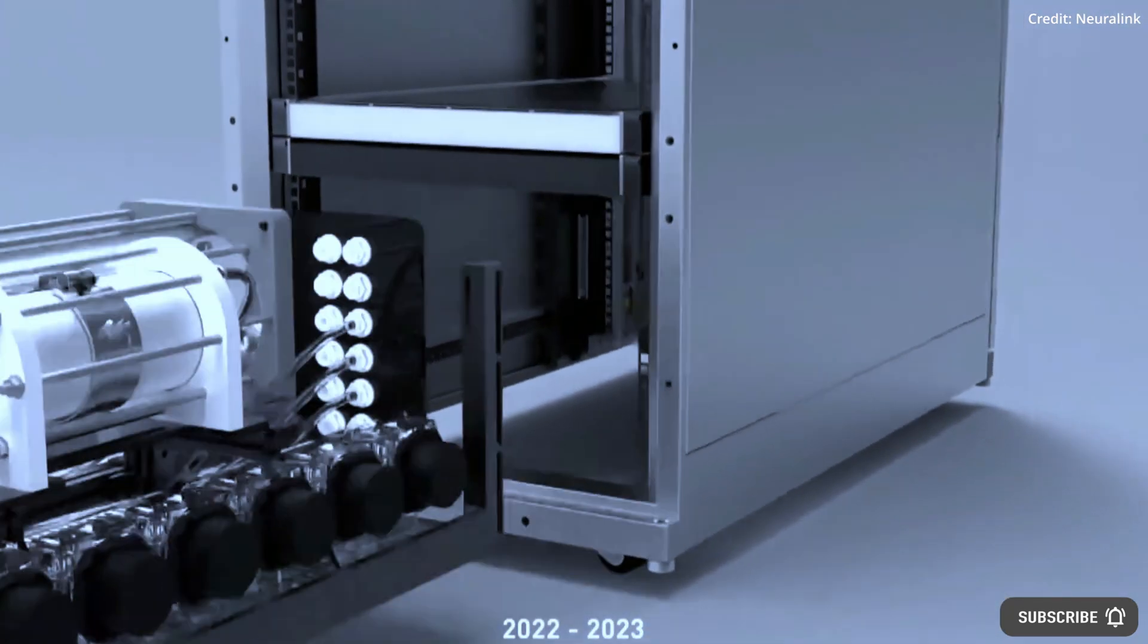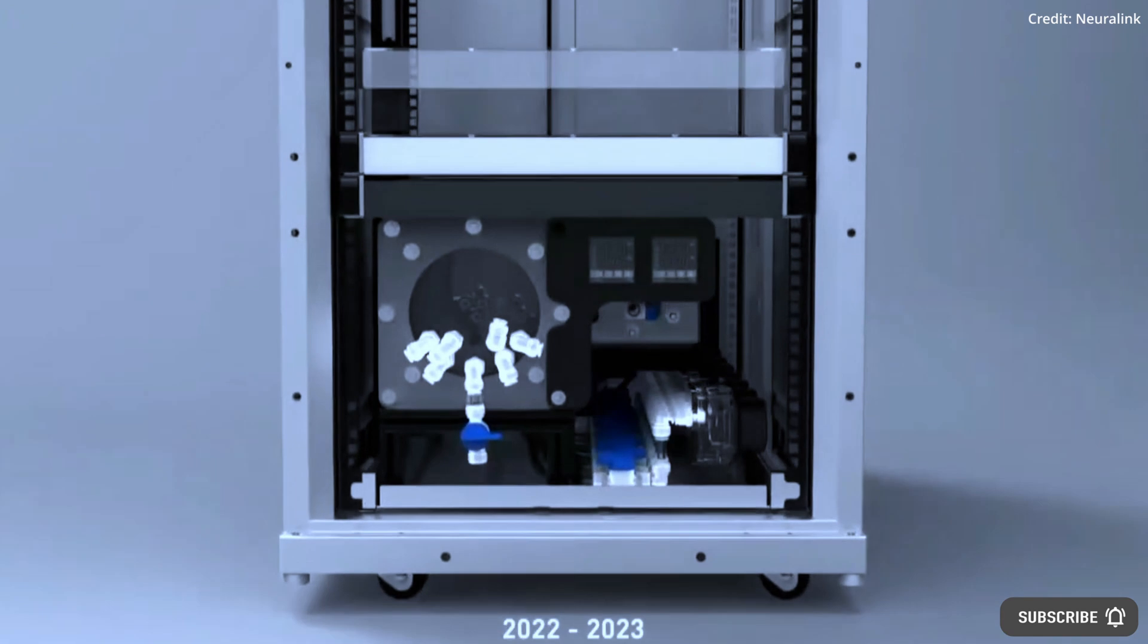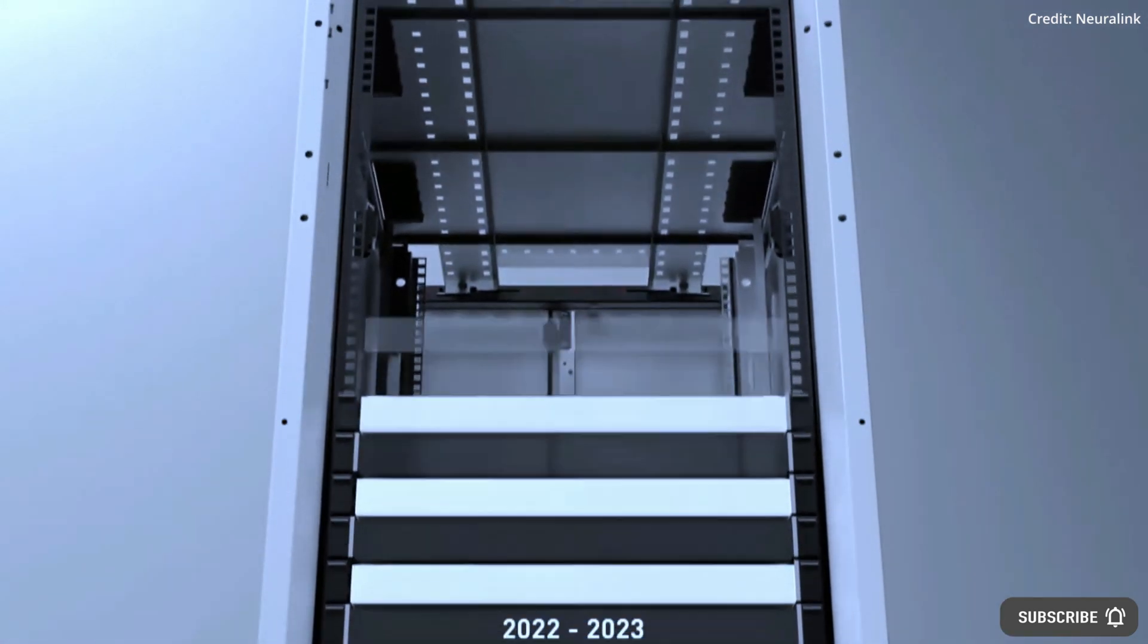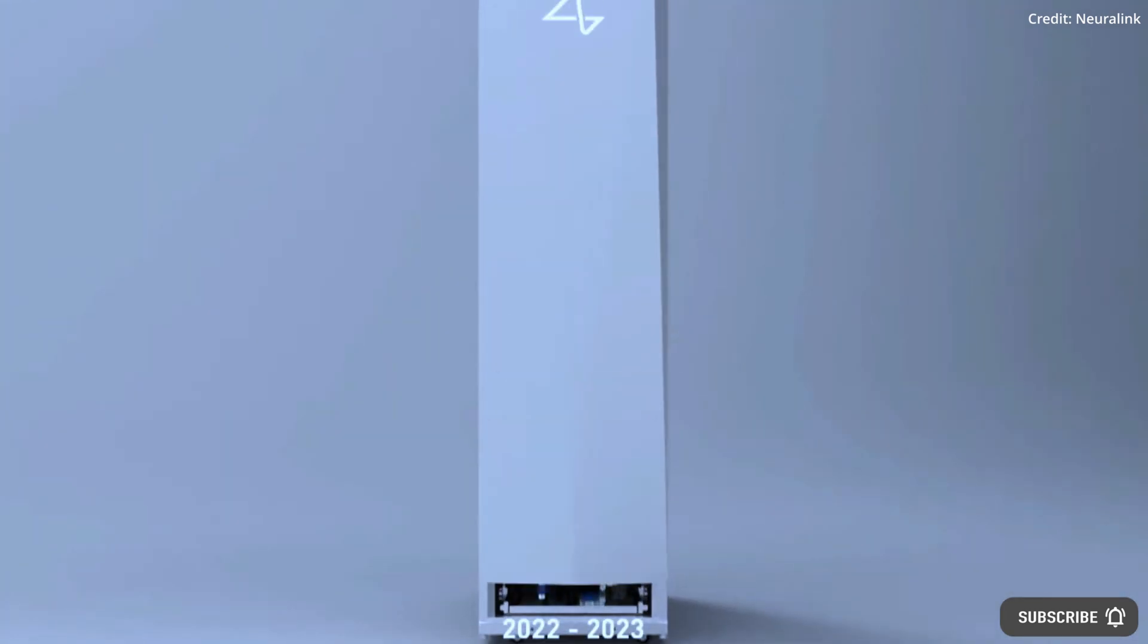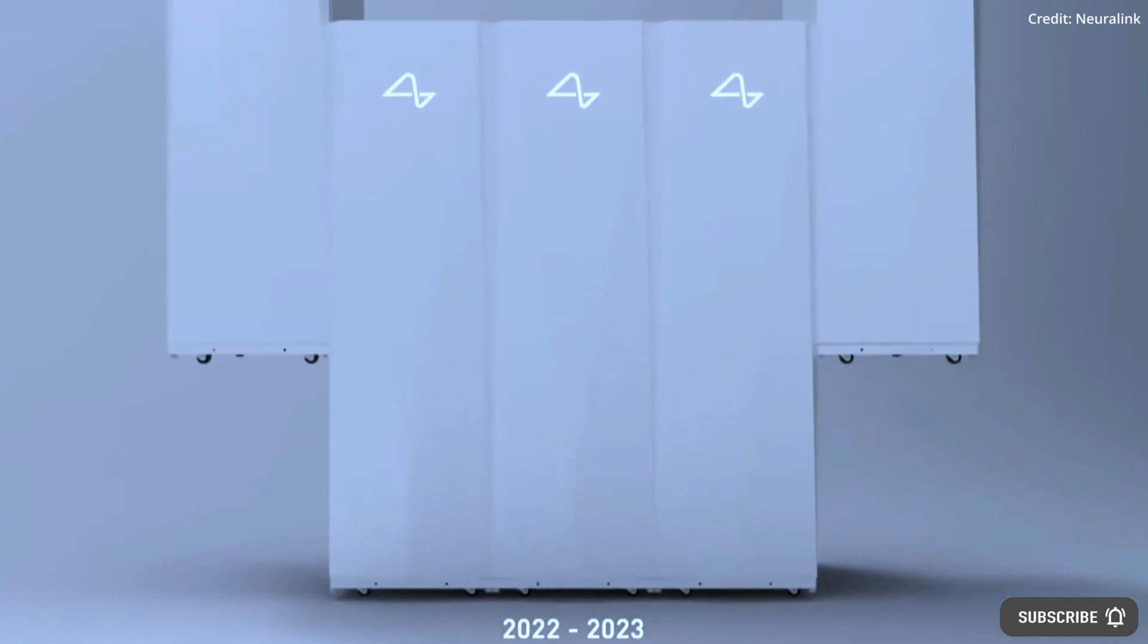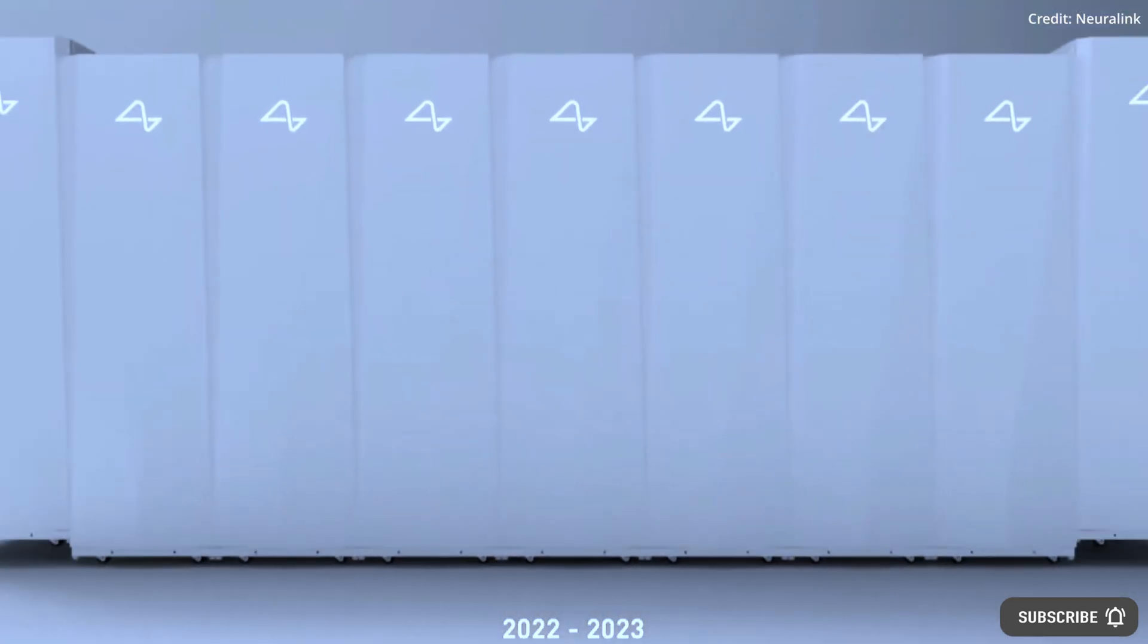The R1 surgical robot will help neurosurgeons to implant Neuralink's N1 chip, and as they continue to improve their surgical device technology, it will automate more and more of the surgery, which will make the R1 robot and the N1 implant surgery procedure more and more affordable in the future.